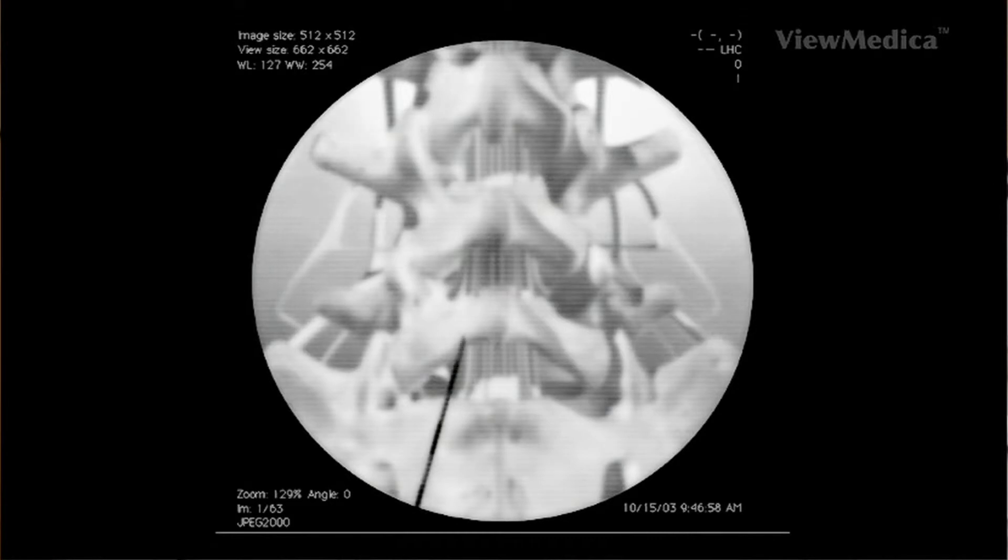Once the tissue is numb, we insert a needle into the skin. The needle is carefully guided down to the facet joint, and we then inject the contrast solution through this needle. The contrast solution helps us see the area on a camera called a fluoroscope.